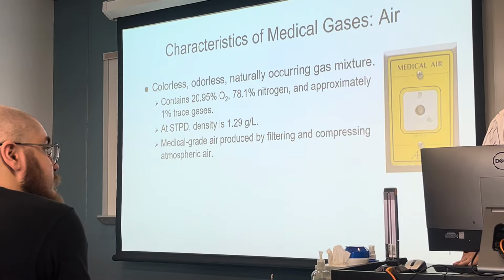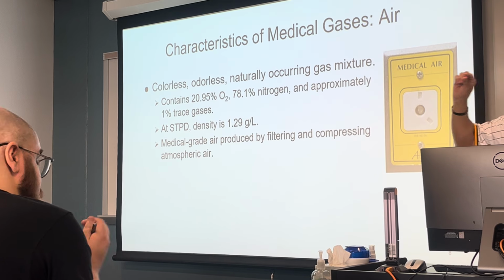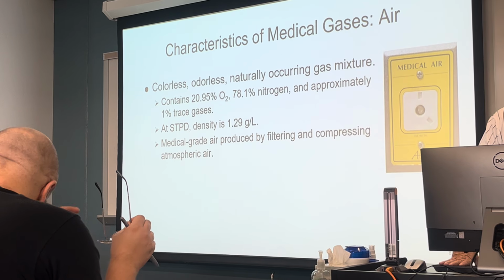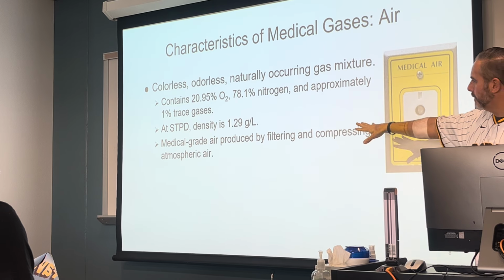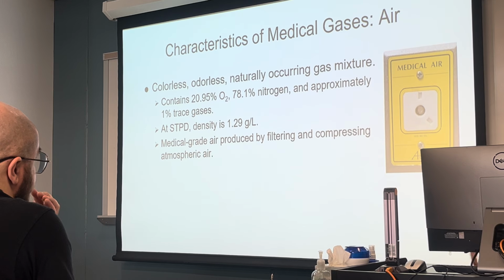Argon. And then there's a touch of helium and some other little touch of CO2, but very, very small percentages of those others. Again, density, don't worry, I'm not going to ask this number, but oxygen was about 1.4, this is about 1.2, 1.3 when it comes to weight or density.